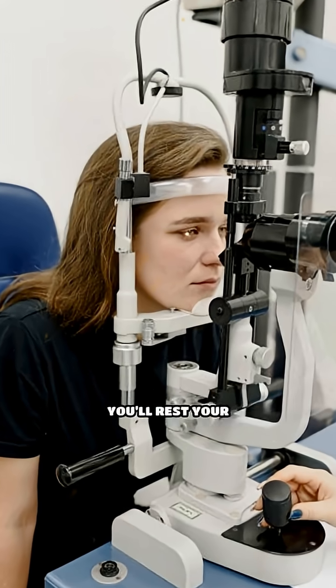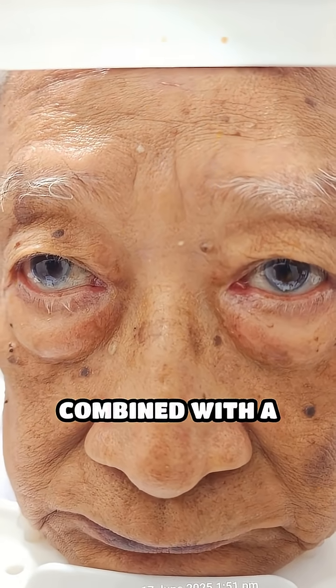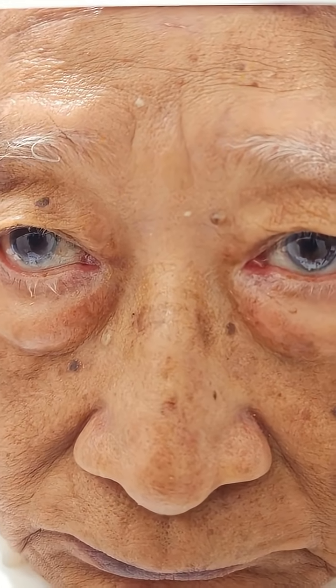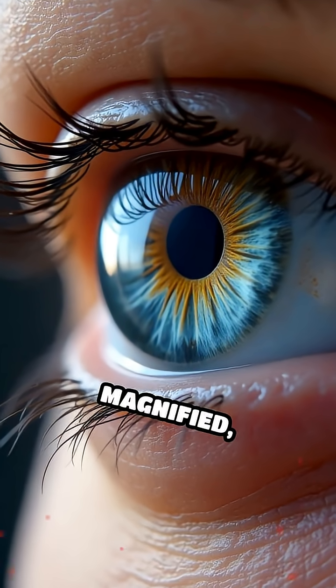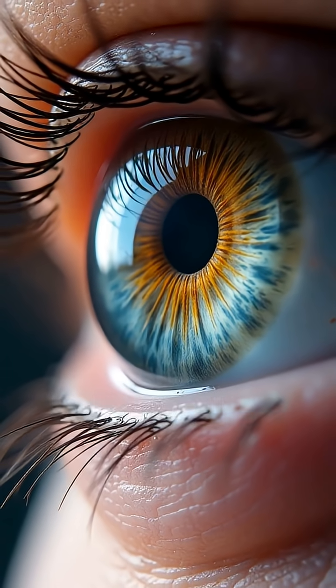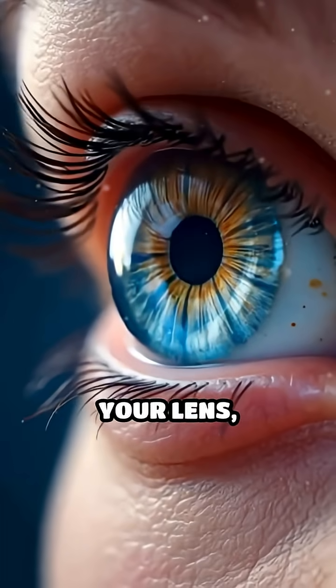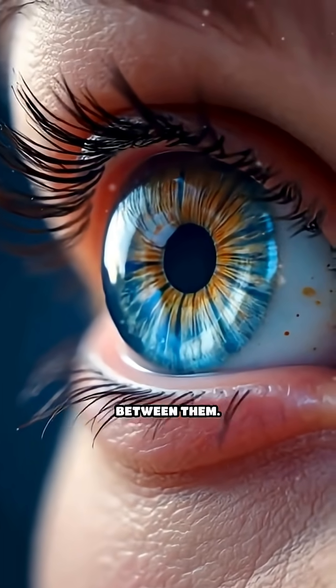During this test, you'll rest your chin and forehead on a support while we use a specialized microscope combined with a bright narrow beam of light. What we see is a magnified 3D view of the cornea, iris — the colored part of your eye — the pupil, then behind that your lens, and the fluid-filled spaces between them.